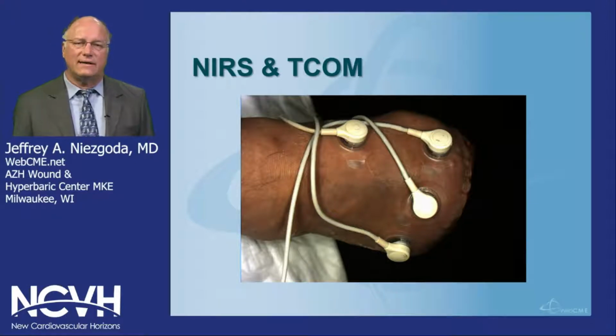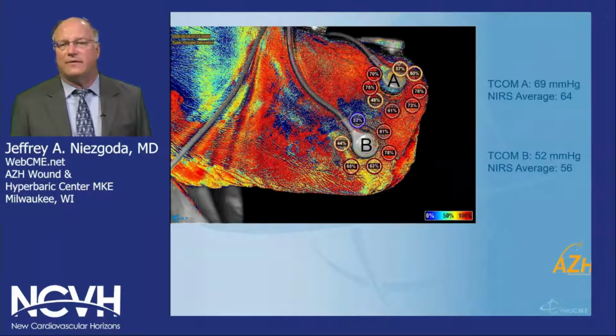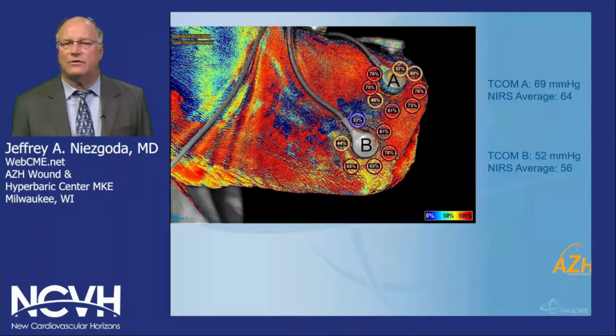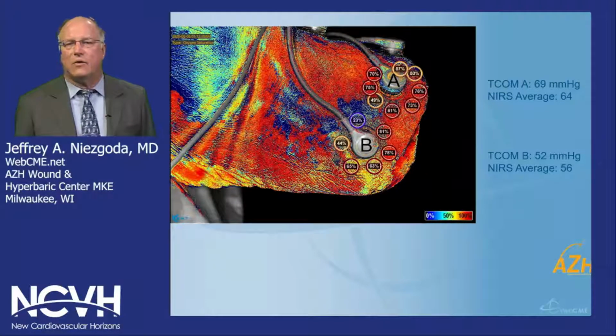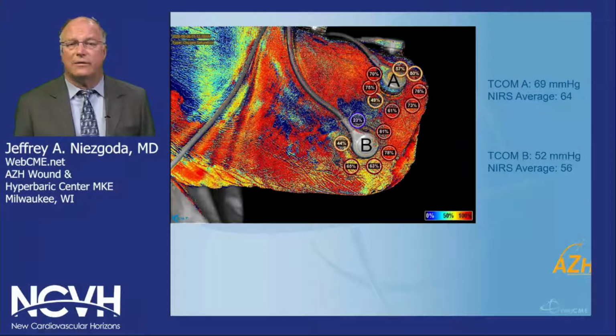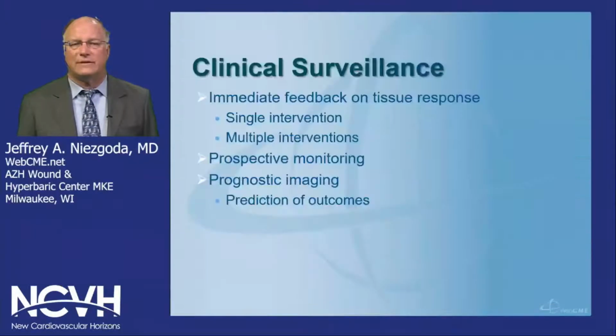We also have decided we can use snapshot NIR to evaluate patients when all we had before was transcutaneous oximetry. As you know, there are many challenges with transcutaneous oximetry. This has been the mainstay treatment in guiding some surgical decisions as well as predicting wound healing. And we have done some evaluation, as have others, where we've compared transcutaneous oximetry values to that obtained with snapshot. The correlation is very tight, and I think that this is going to be much more efficient in getting data to determine tissue oxygen saturations as opposed to the old TCOMs. And we have actually talked about this on podium presentations and multiple poster presentations.